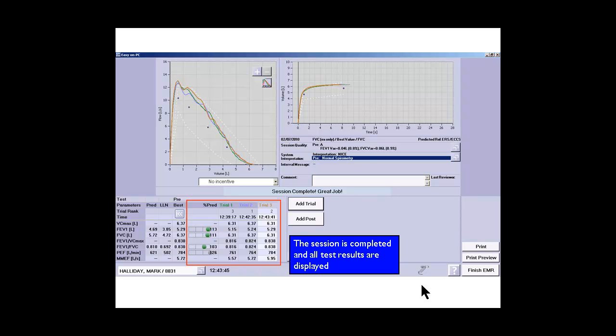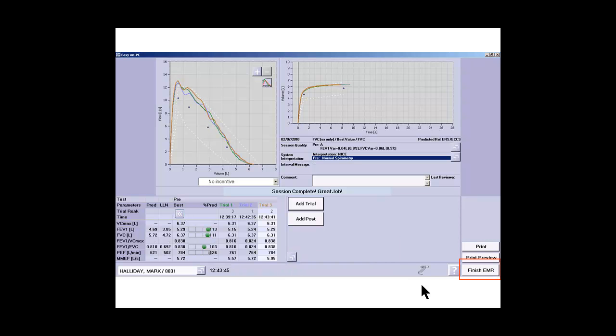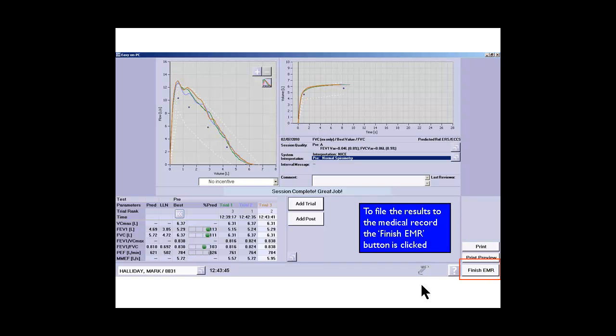We can see that we have three trials now and it's telling us that the session is complete. Great job. At this point we are ready to export to the medical record so we click on the finish EMR export to medical record button.